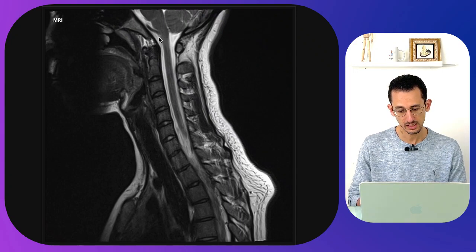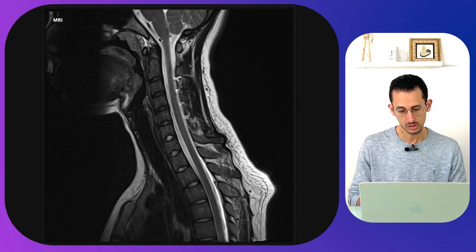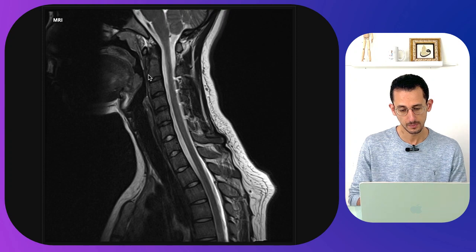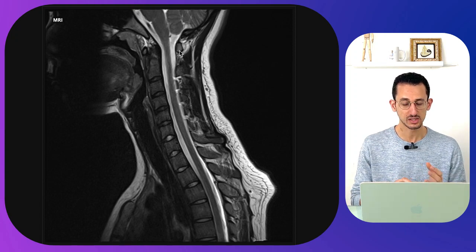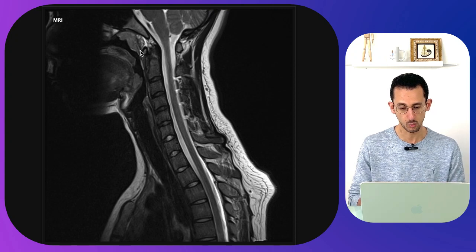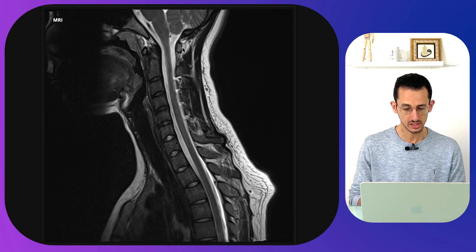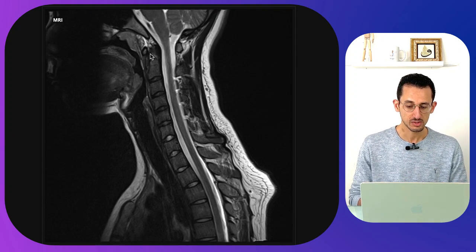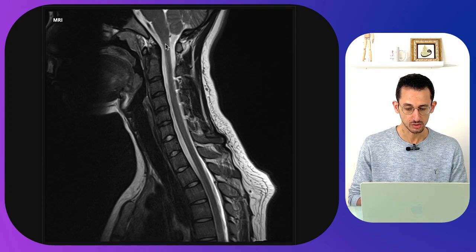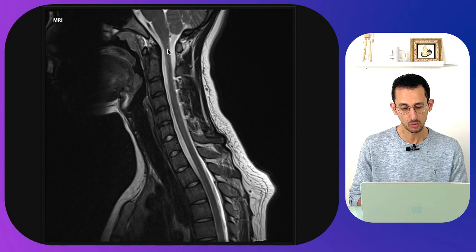What looks like a bullet shape is the C2 odontoid and then the C2 body. We have a little part of bone anteriorly and posteriorly, representing the anterior arch and the posterior arch of C1, with the C2 odontoid fitting inside. Then we have the spinal cord, which is the gray structure extending all the way down through the spinal canal.